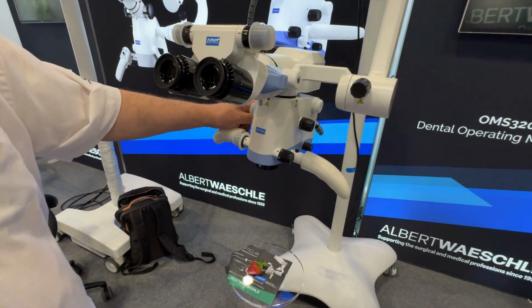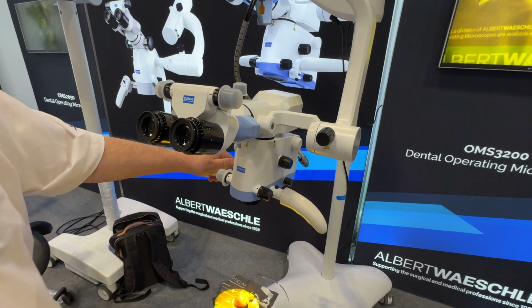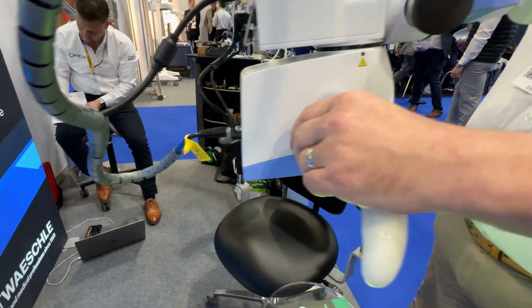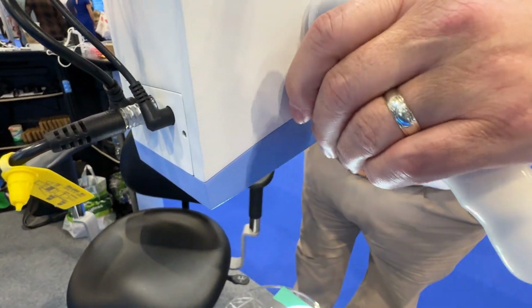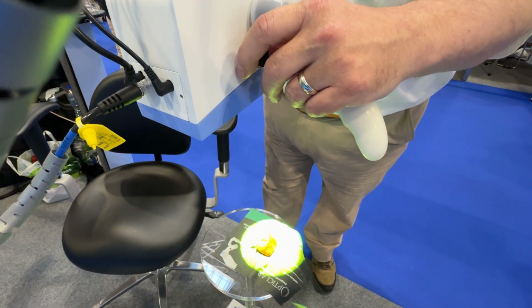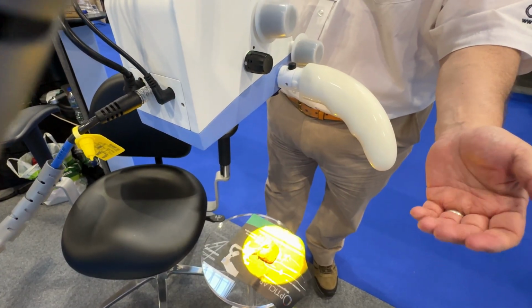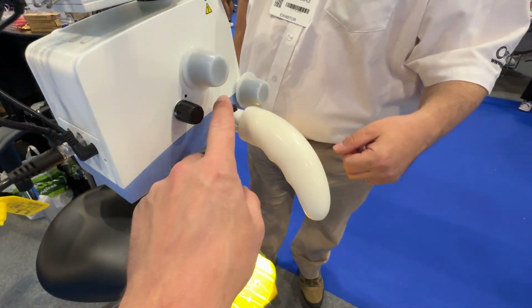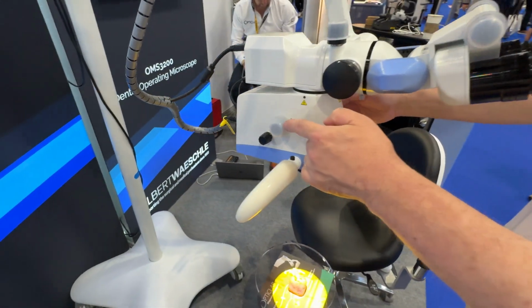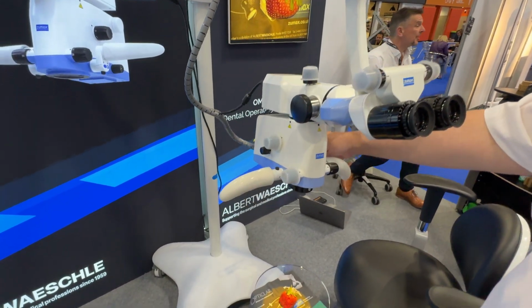This is gorgeous. Then you've got your different filters. You've got small light spots, and at the click of it you can just go around. So there you go, there's a green filter. Your standard is white. The green you probably wouldn't use; the green shows up blood vessels, so I don't tend to use that. And there's the yellow filter, which you will use a lot. Is that also the button for the...? That's exactly it. They're just replicas of the buttons that are on the other side. So the only other button is this one, which is the light brightness.